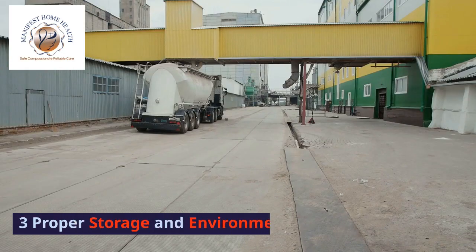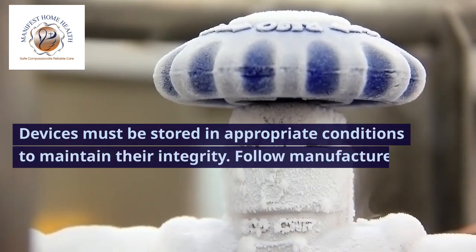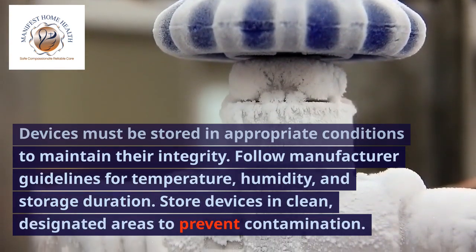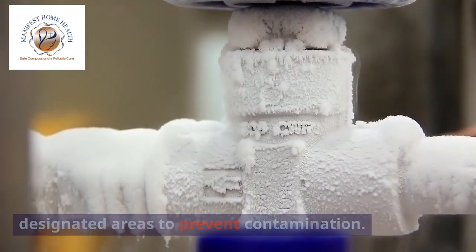3. Proper storage and environment. Devices must be stored in appropriate conditions to maintain their integrity. Follow manufacturer guidelines for temperature, humidity, and storage duration. Store devices in clean, designated areas to prevent contamination.